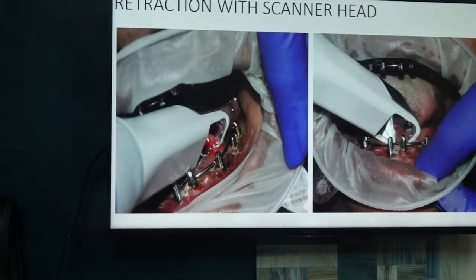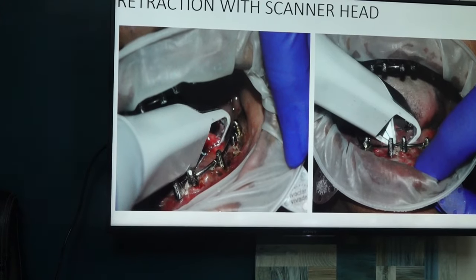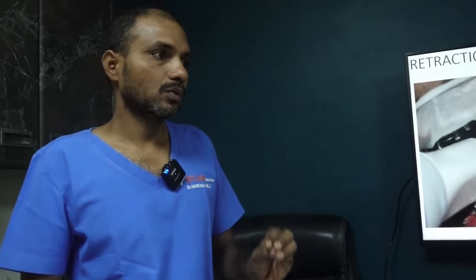These are the small things. If you follow that, you will get success. There is no need to rush, and no need to get tense when scanning. You have to keep this in mind and do it slowly. The more slowly you do these things, the faster it will be. There is no need to use any muscle power here. Just these simple tricks. It won't take more than 1 to 1.5 minutes per arch. Both arches, it is 3 to 4 minutes, that's it.